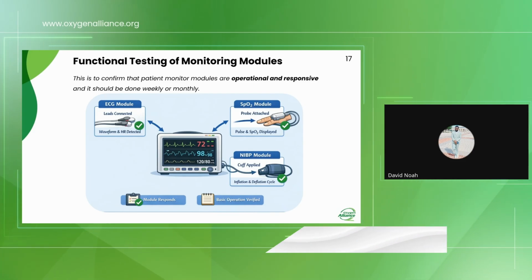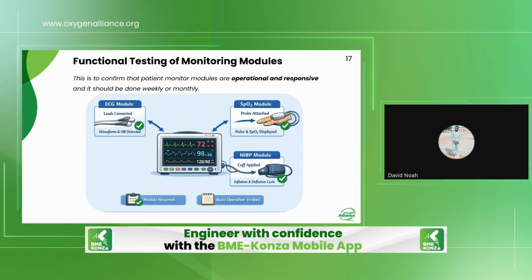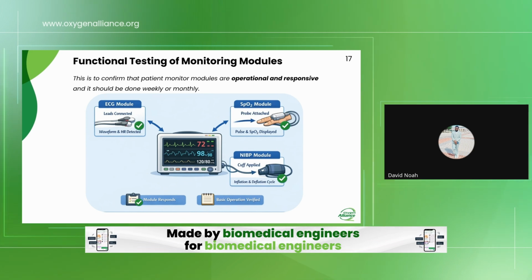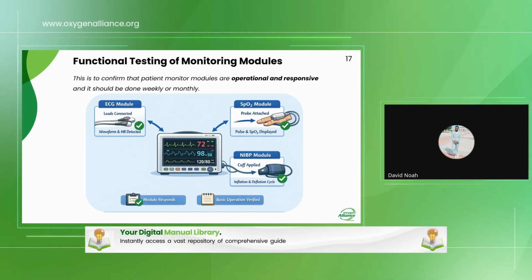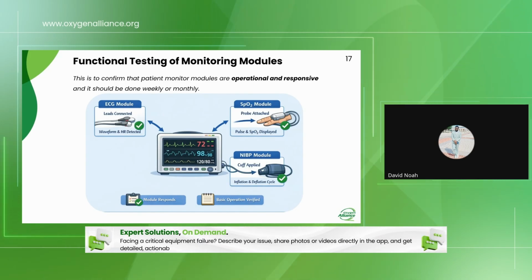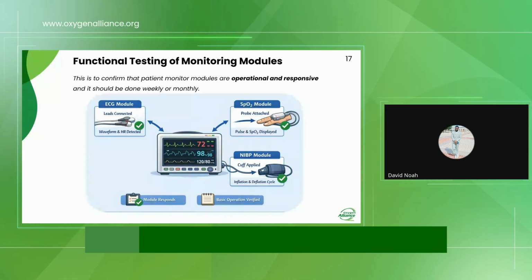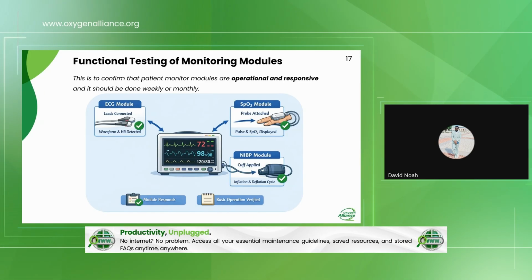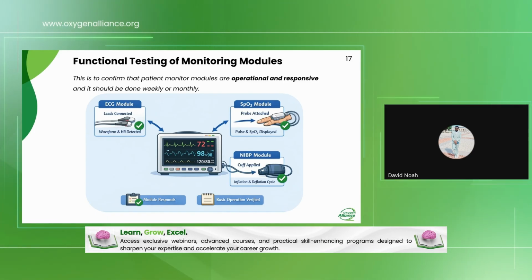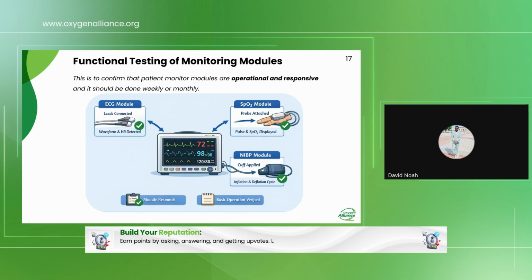And for the NIBP module as well, you simply apply the cuff to the patient and check if the monitor is able to inflate and deflate the BP cuff. And for the ECG, you simply connect the leads and check if the monitor is able to display the waveforms and calculate the heart rate.